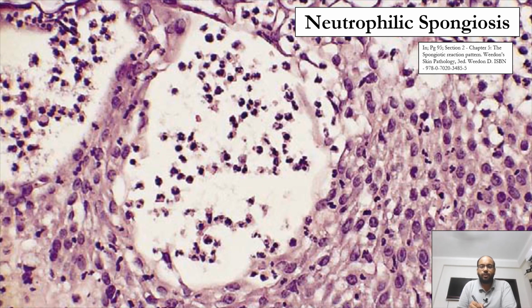Yeah. So if you look closely, you will see the cells have a multilobulated nucleus. The nucleus is there in multiple lobules. If you look closely and carefully, you will see that these cells are not keratinocytes. They are smaller than keratinocytes and they have multiple lobules in the nucleus, making it a more multilobulated cell. That is because they are neutrophils. And when neutrophils are there in the spongiosis or the spongiotic vesicle, we call it neutrophilic spongiosis.